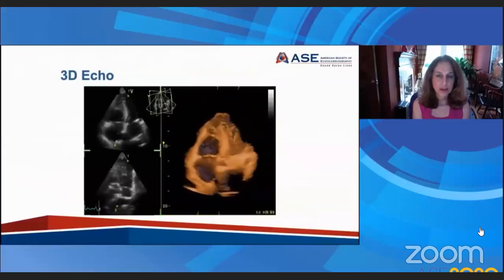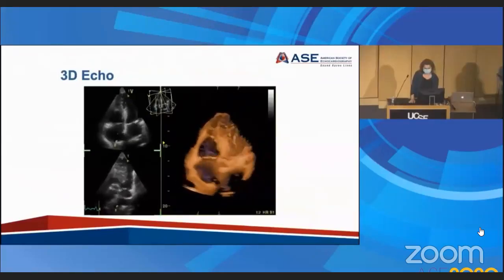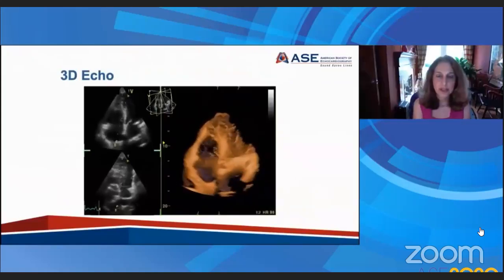Here's a three-dimensional echo of the patient with the apical septal VSD, and the 3D echo can be used to actually measure the size of the defect. Next slide, please.